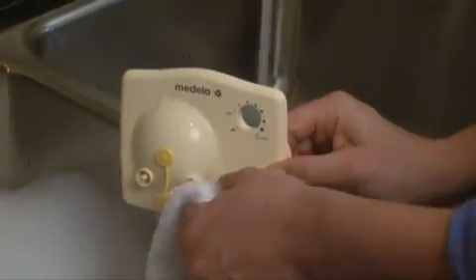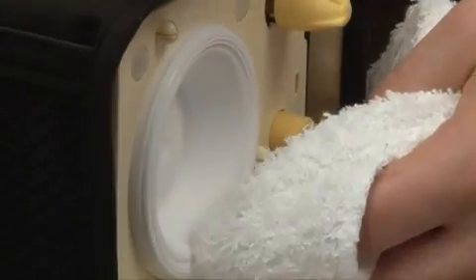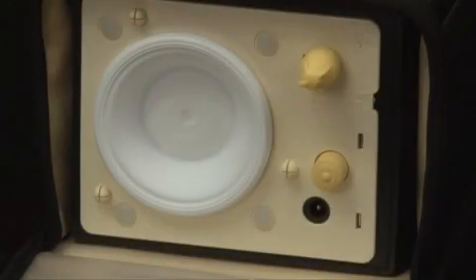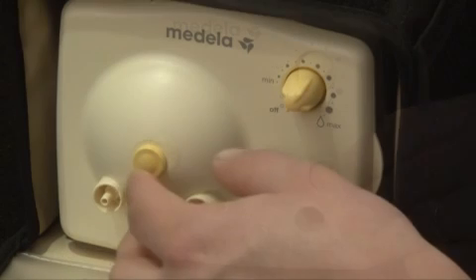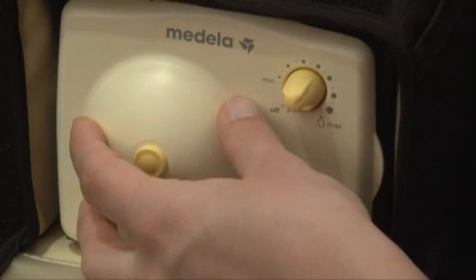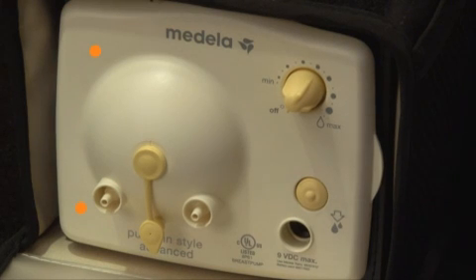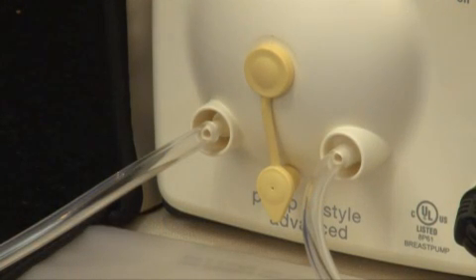Wash the faceplate in warm soapy water, then rinse in cold clear water. Use a damp, clean cloth to wipe the pump diaphragm. Let faceplate and diaphragm completely dry. Reattach the faceplate by holding the back of the pump with one hand and pushing on the faceplate until it snaps into place. The faceplate needs to snap securely at all 3 connection points to ensure adequate vacuum and optimum pump performance. If tubing is still wet, attach to pump and run for 1 to 2 minutes or until dry.